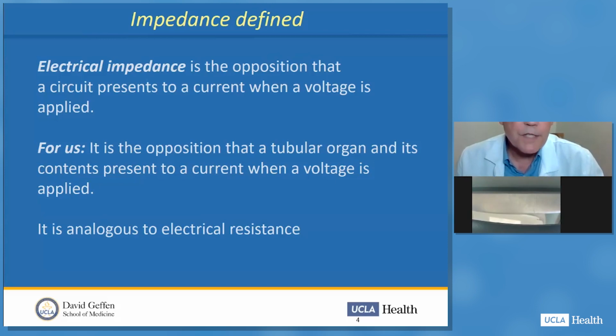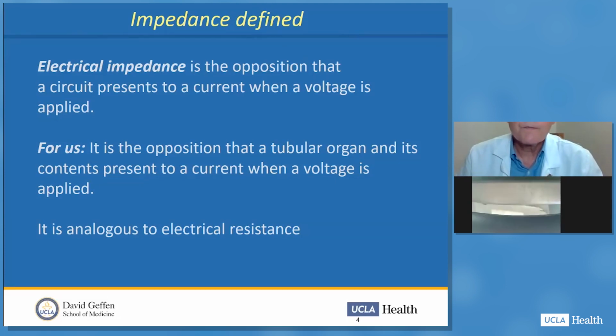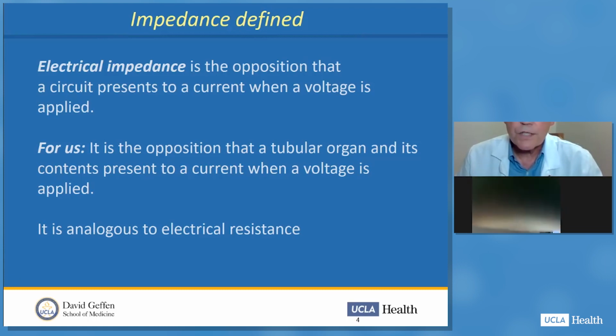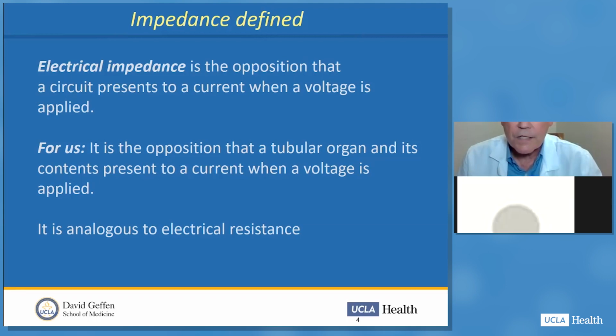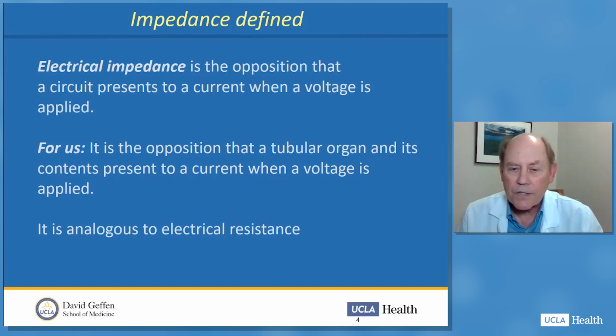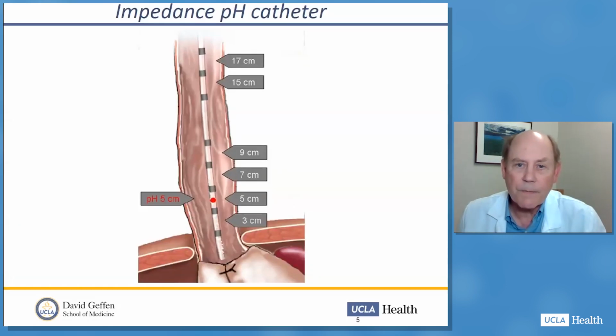So this is probably the scary part. What is electrical impedance? Well, it's the opposition that a circuit presents to a current when a voltage is applied to that circuit. For us, as gastroenterologists, it's the opposition that the tubular organ, the esophagus, and its contents present to a current when a voltage is applied. Impedance for the purposes of this talk is going to be analogous to electrical resistance because electrical resistance is easier to understand than impedance. But they're about the same kind of thing.